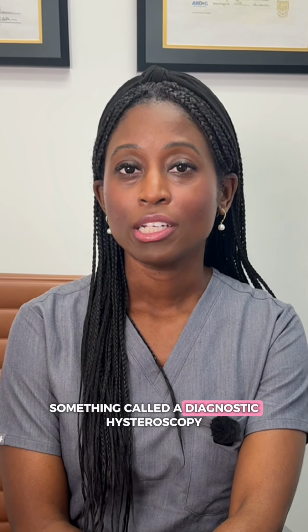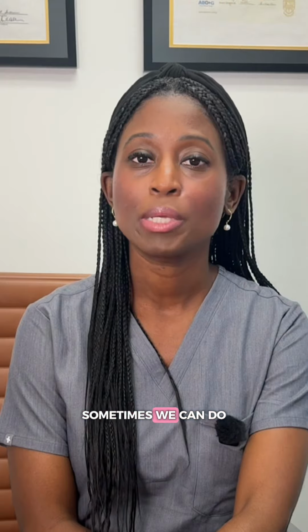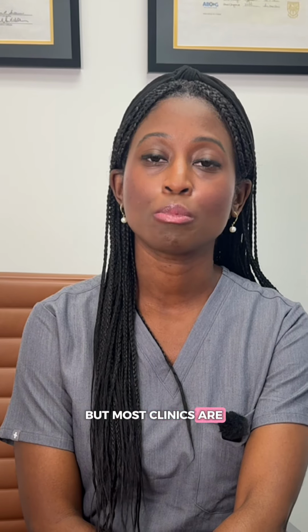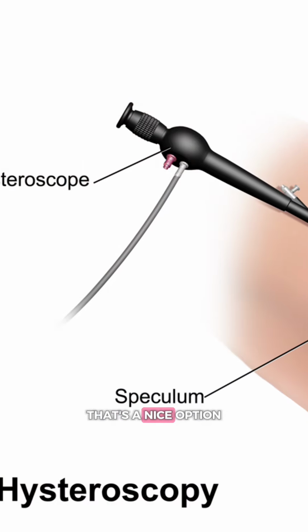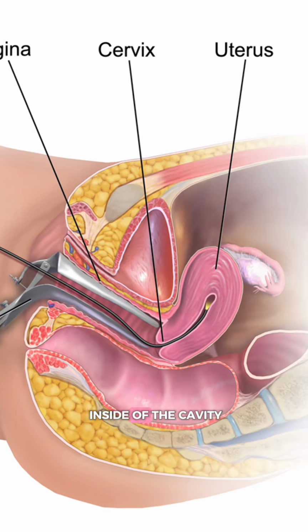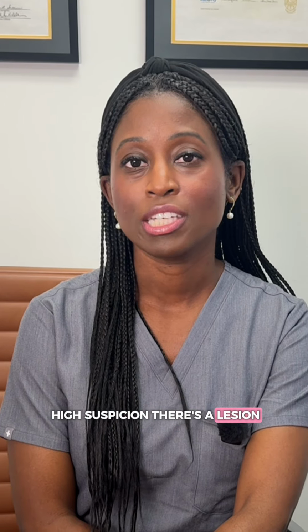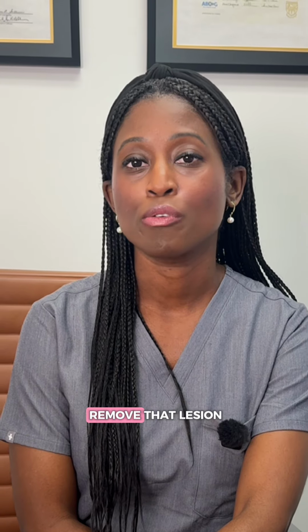inside of your uterus. The other option is something called a diagnostic hysteroscopy, and that's typically performed in the operating room. Sometimes we can do it in the office, but most clinics are performing them in the operating room. That's a nice option because it also allows us to introduce a camera and actually visualize the inside of the cavity. And if you're already under anesthesia and we have a high suspicion there's a lesion, we can operate at the same time and remove that lesion.